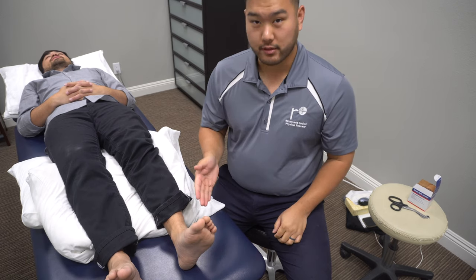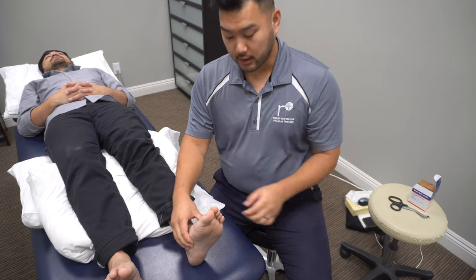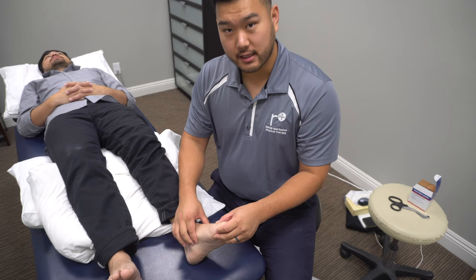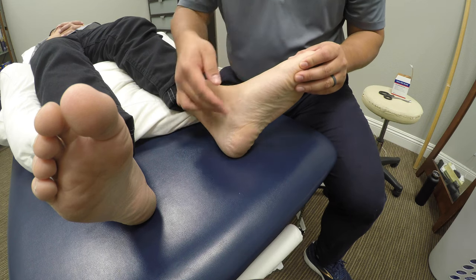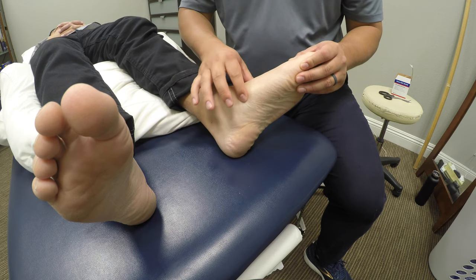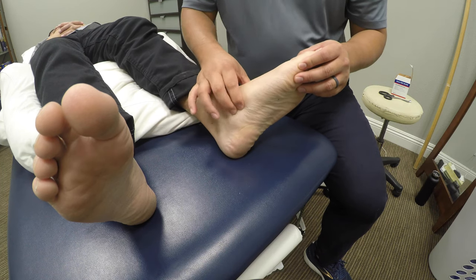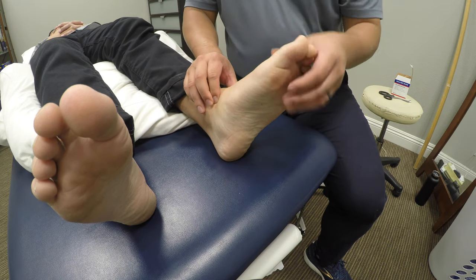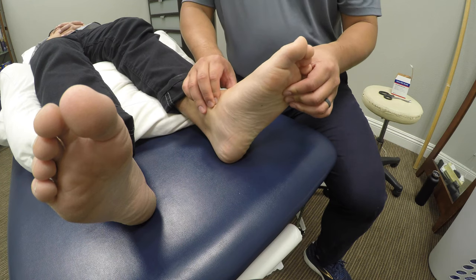So we're going to take Griffin's foot. We saw that his foot was really collapsing on this side. We're going to help him support his own arch by lifting this bone called the navicular. You can find it sort of in the apex of the arch, not necessarily in the center of his foot, but sort of behind it. You can palpate or feel for this bone here. We want him in subtalar neutral — not pronated or supinated, but right in the middle.